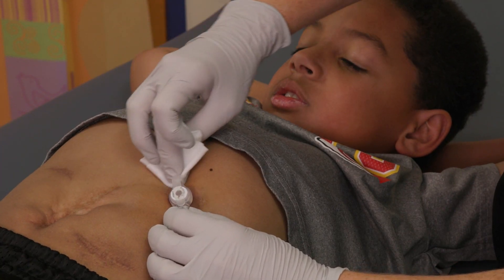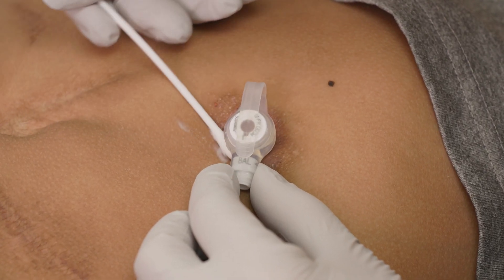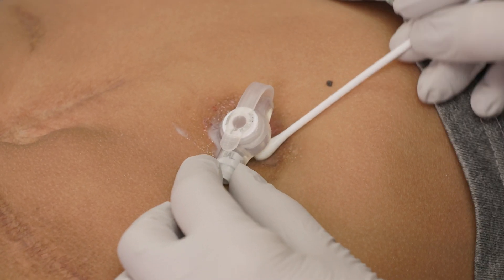The feeding tube site should be gently cleaned with soap and water one to two times a day. A Q-tip can be used to dry hard-to-reach areas in the skin underneath the button.